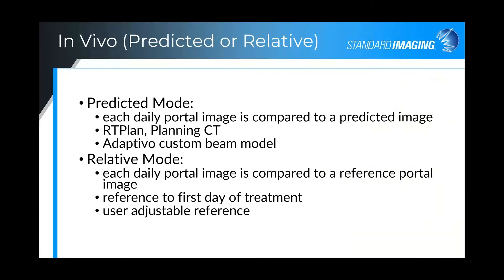With the in vivo module, one can do the comparison either in predicted mode or in relative mode. In predicted mode, with each daily portal image we compare to a predicted image. This predicted image is generated based on the RT plan, planning CT, and other components from the treatment planning system, and predicted using a custom beam model.